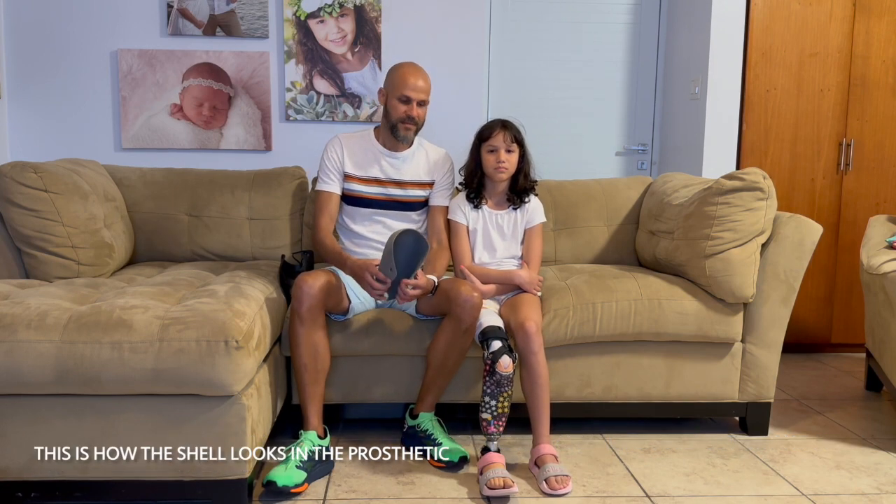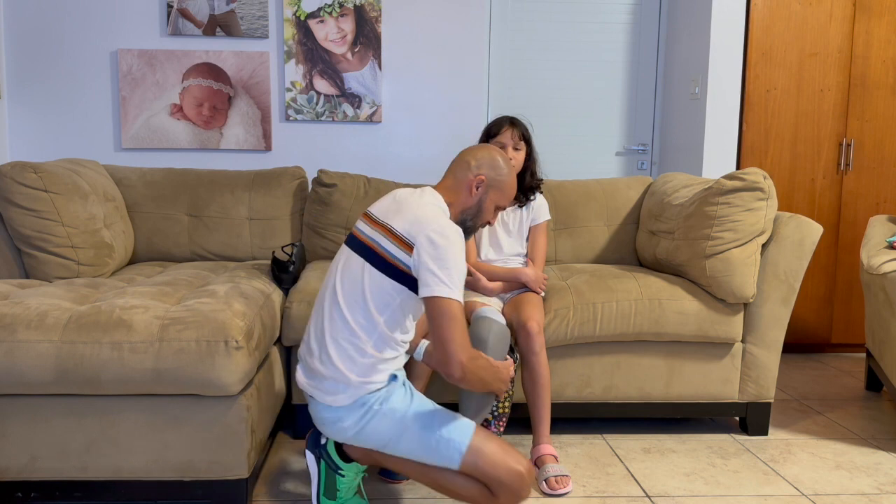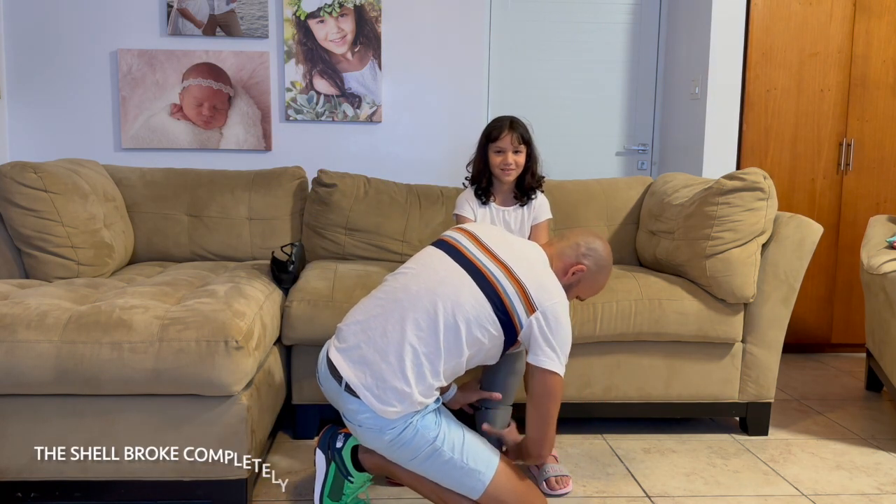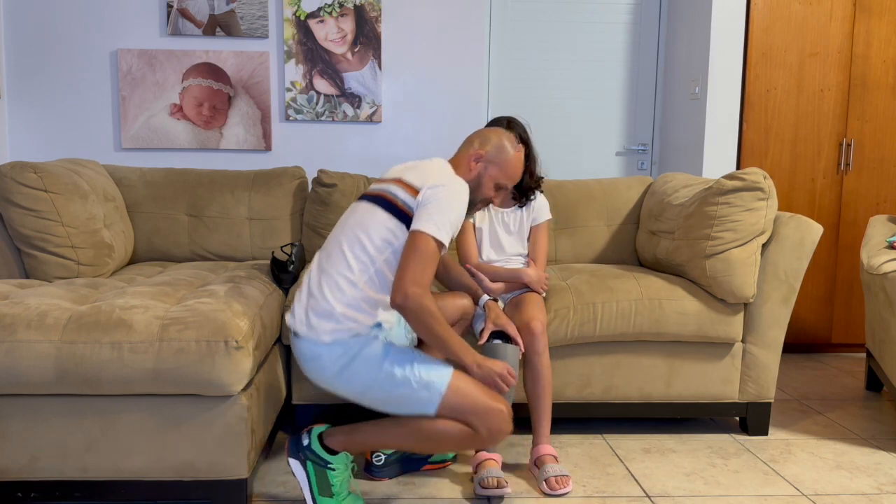This is how the shell looks on the prosthetic. So that's the idea of the shell. Thank you.